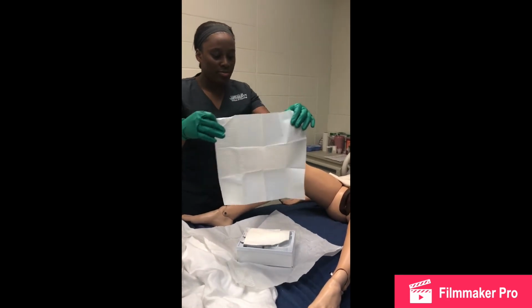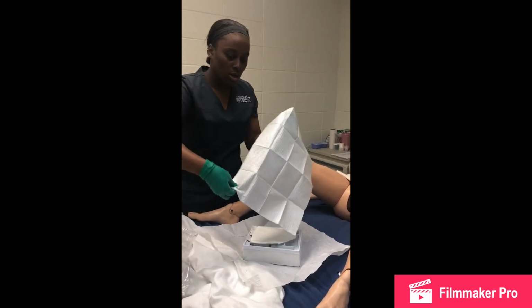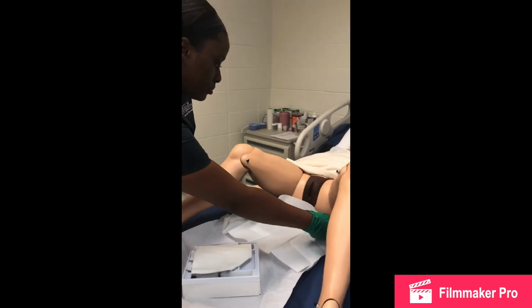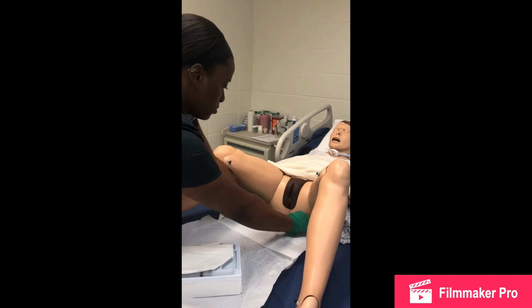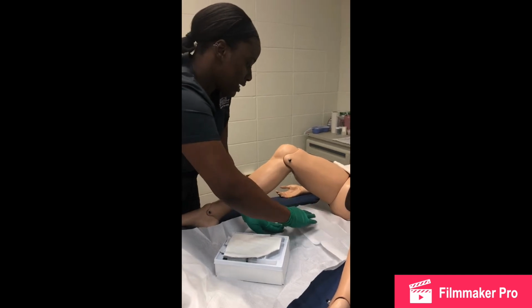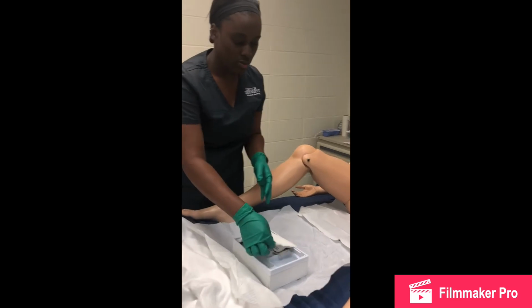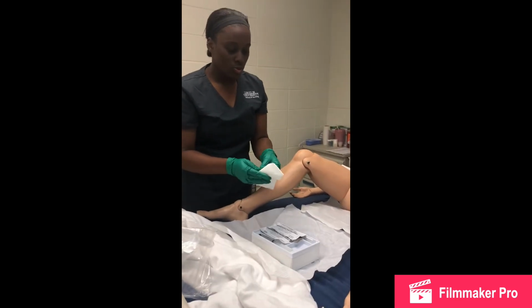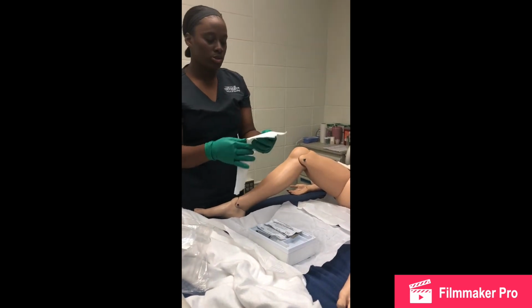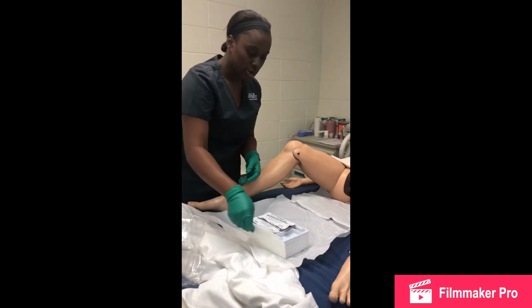get my absorbent pad, right? I'm going to carefully place it under the patient without my sterile gloves touching the sheet or anything. Okay, so now that I have carefully extended my sterile field, I can now proceed on with my procedure. With this, we can use these sometimes over the patient, but with a female patient, I'm not going to. It's more ideal with a male patient. So I'm going to carefully rest this right here at the side.